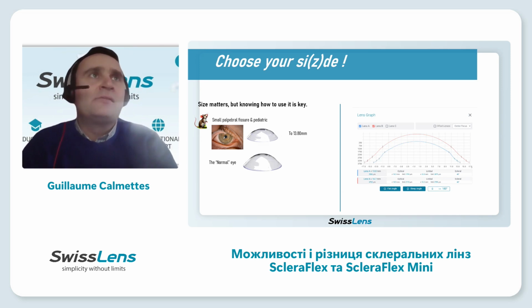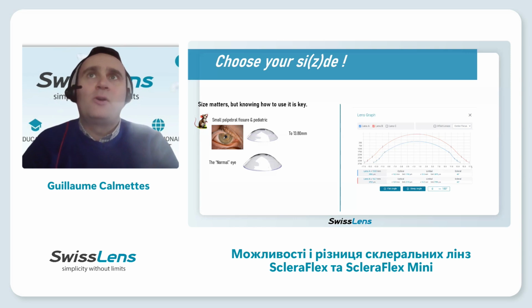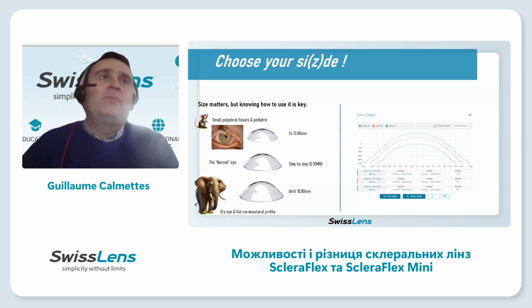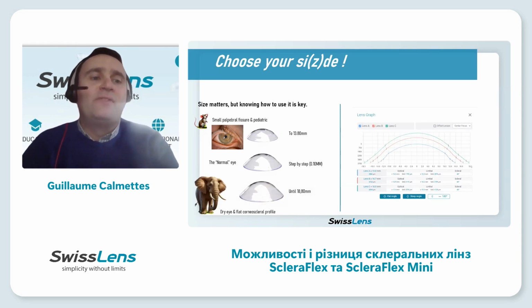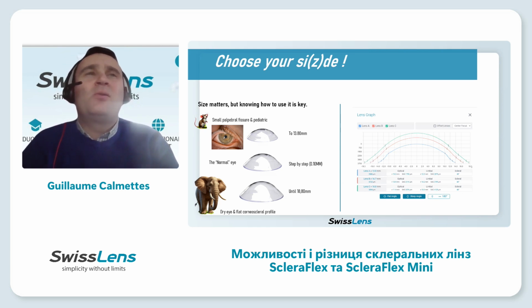Sometimes we have normal eyes. That happens. Not with scleral lenses, it's not very common, but sometimes we have normal eyes. What is a normal eye? It's an eye with a palpebral fissure that is quite normal, nothing to say about it. But sometimes we also have a very, very big eye, and we need a large scleral because of dry eye disease and some corneal conditions.